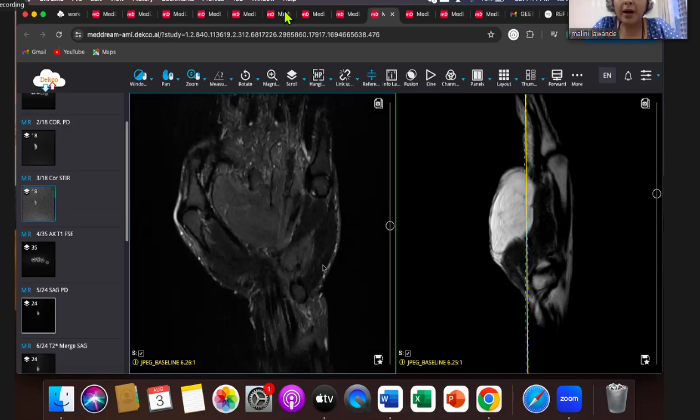Management-wise, lipoma and atypical lipomatous tumor, there is no differentiation. Both will be managed similarly, with resection. The only thing is, with atypical lipomatous tumor, follow-up may be done to exclude any recurrence, because there is a chance of recurrence, though not very commonly, but that's the only difference. And we need to differentiate it from liposarcoma, for which we are looking for areas of heterogeneity. We are looking for solid areas. And remember, liposarcoma may not always have fat, because liposarcoma has a whole different type.